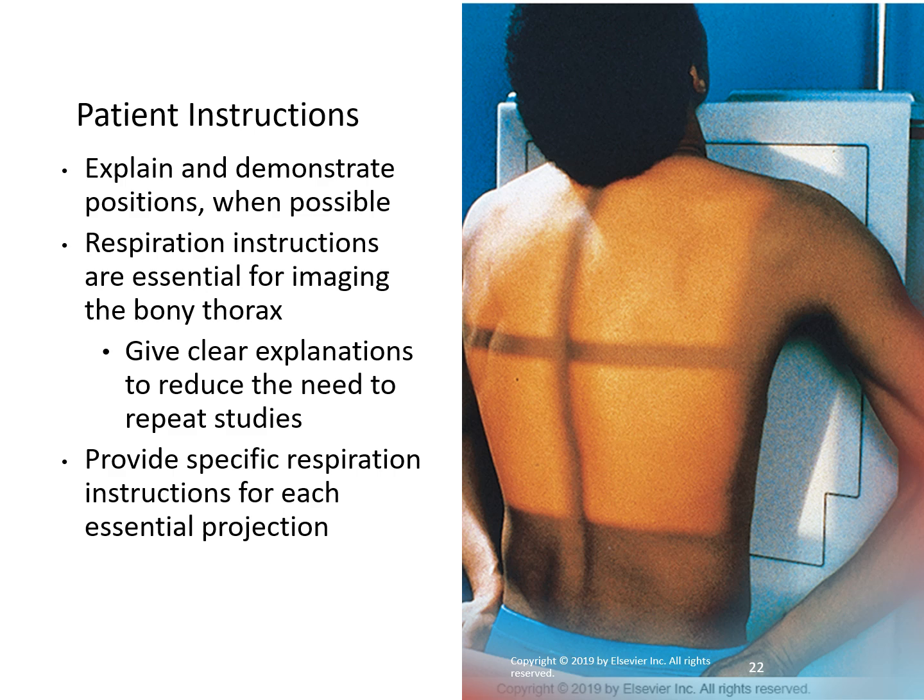You don't want high penetration because you want the ribs to actually attenuate and absorb those low energy photons. Remember, photoelectric effect is more probable with low kV. The ribs are really thin, okay? They're not very broad in diameter. And so in order to promote photoelectric absorption, we need the average beam energy to be very low, so we get a good photoelectric response from the calcium that is in the thin ribs, okay?